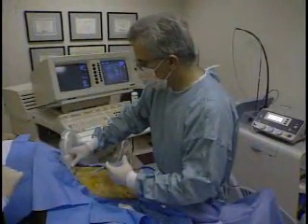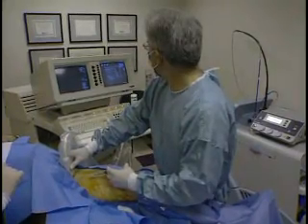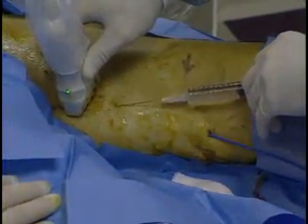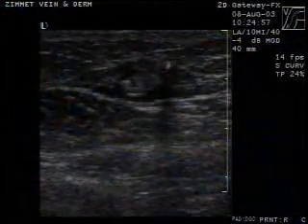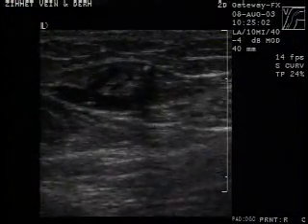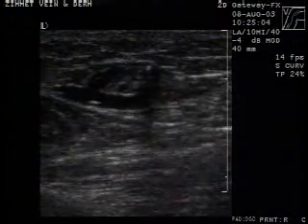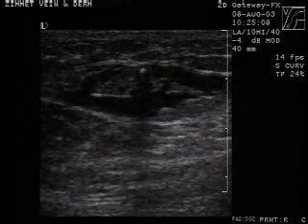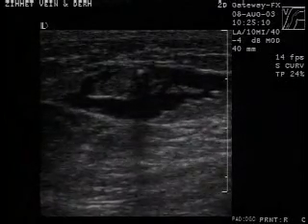Deliver adequate tumescent anesthesia under ultrasound control, intrafascially around the GSV from the SFJ to the point of needle access distally. In addition to the anesthetic effects, properly delivered this fluid compresses the vein and provides a heat sink to minimize the possibility of heat-related damage to adjacent tissues.